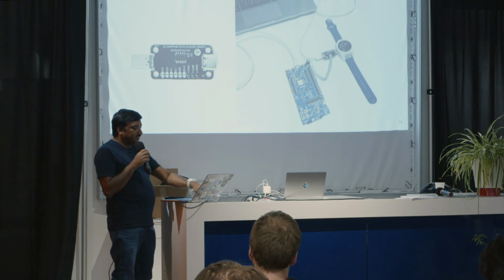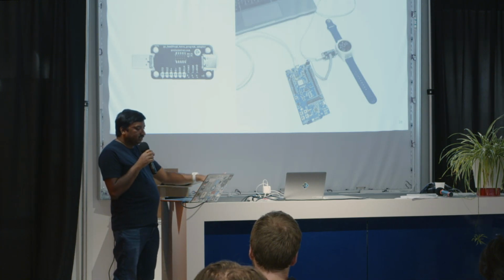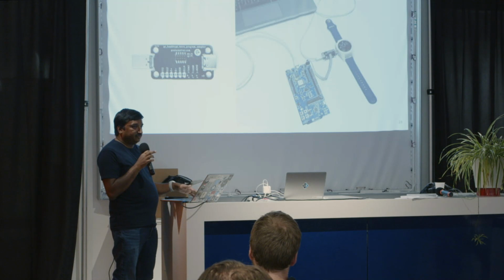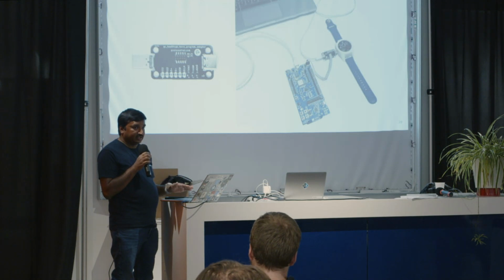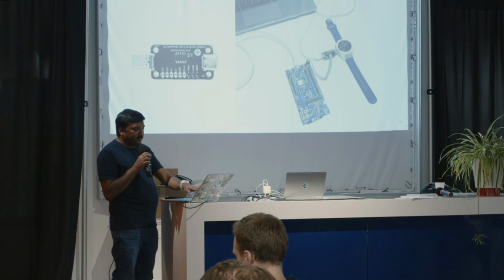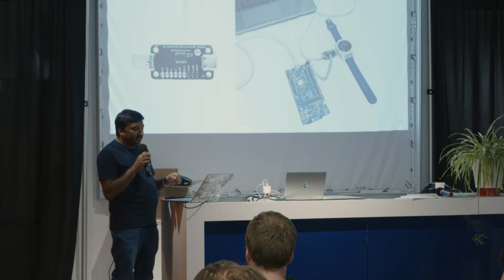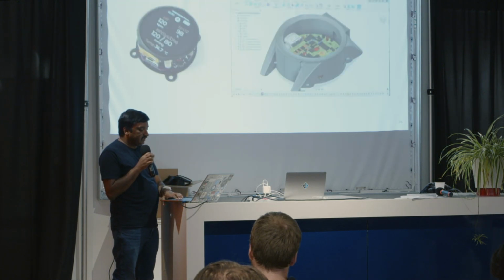So this plugs into the HealthyPi Move. This is a regular USB port, and this is how you can connect your debugger. This is just a regular Nordic NRF development kit, which is pretty cheap. They're much cheaper than the Segger J-Link debugger, so it's about $50. You can just run a cable from there to our board and plug it in, and you have JTAG access while USB is also flowing, so it doesn't affect the D+ D- lines.